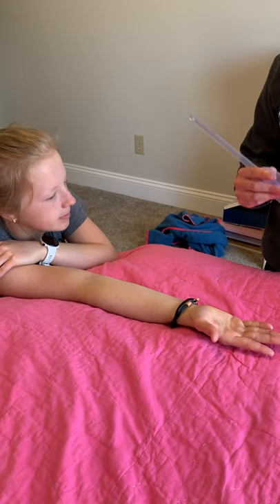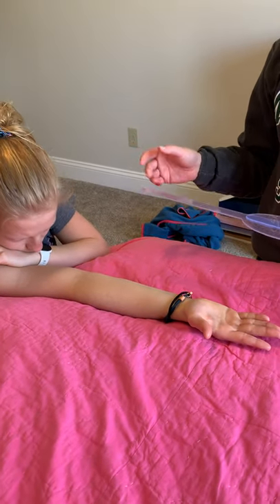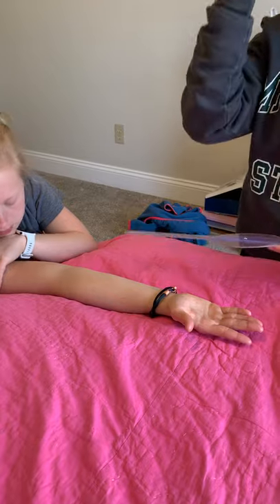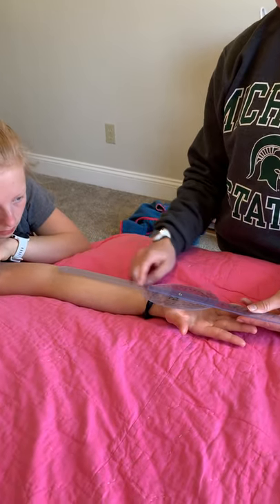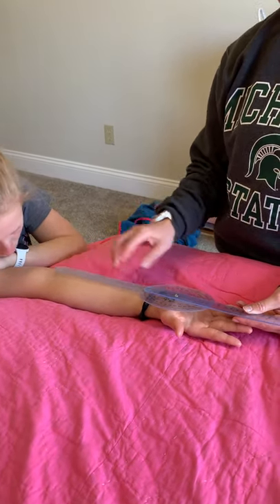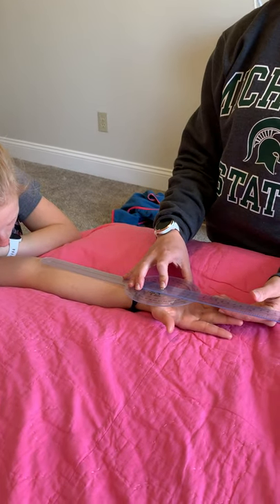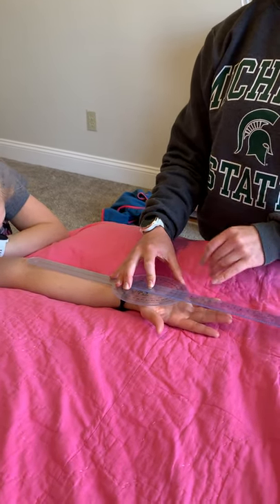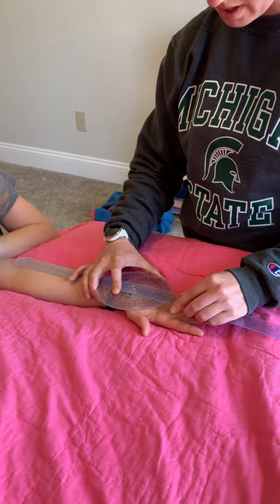For ulnar deviation of the wrist, all the markers are the same as radial deviation. The stationary arm is placed in line with the middle forearm, the axis goes through the capitate or the middle of the wrist, and the third metacarpal is the moving arm.